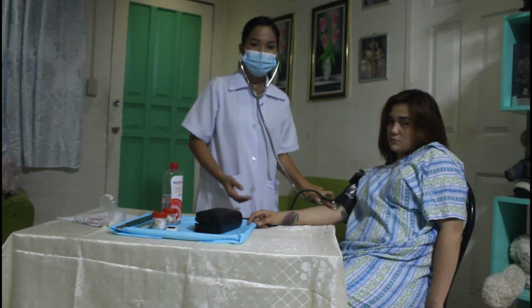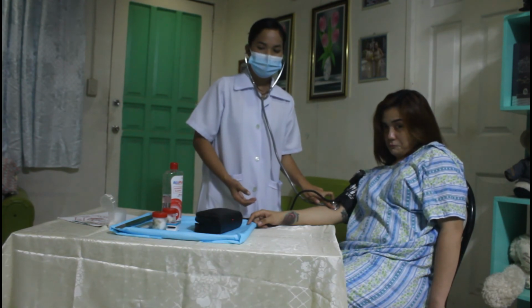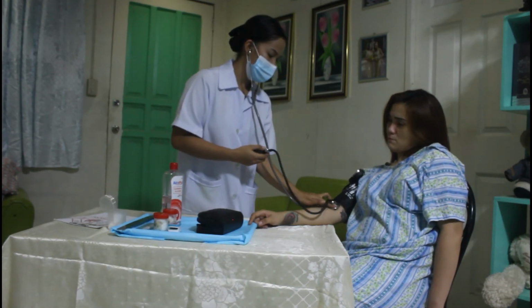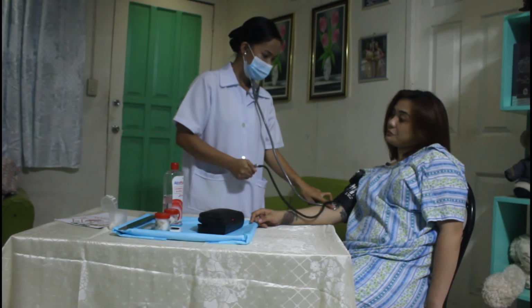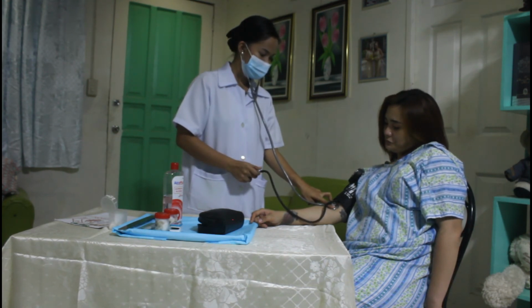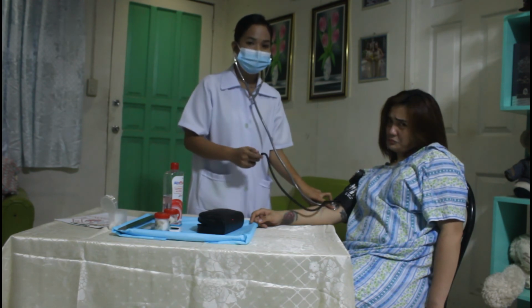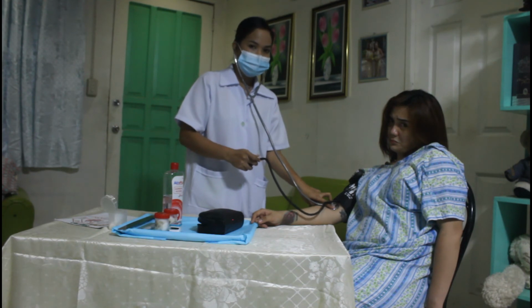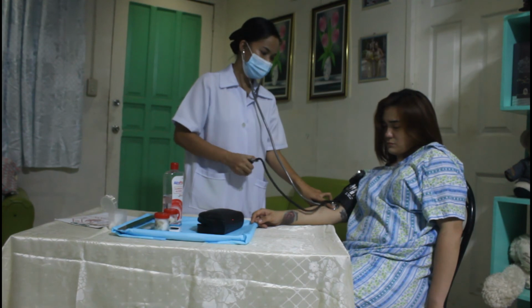So proper stethoscope placement ensures the sound's reception. Then close the valve of pressure clockwise until it's tight. So tightening of the valve prevents air leak during inflation.